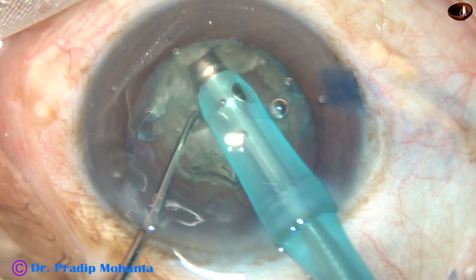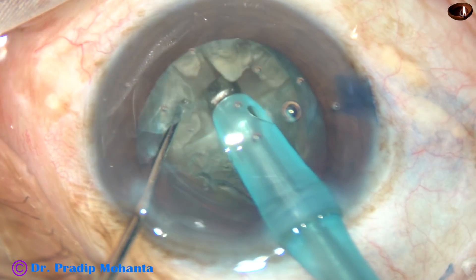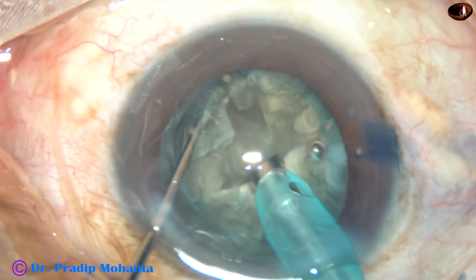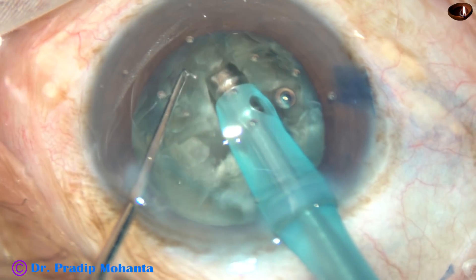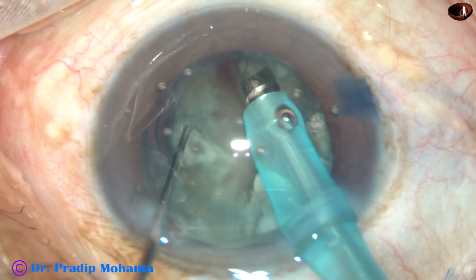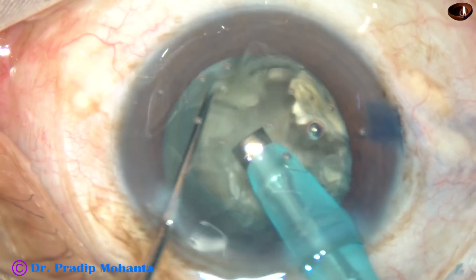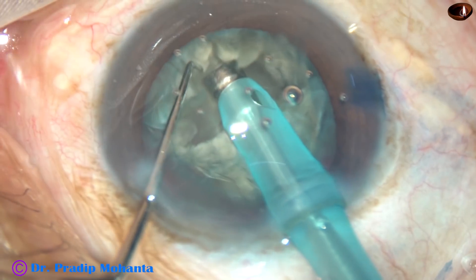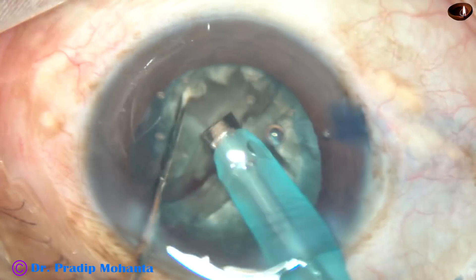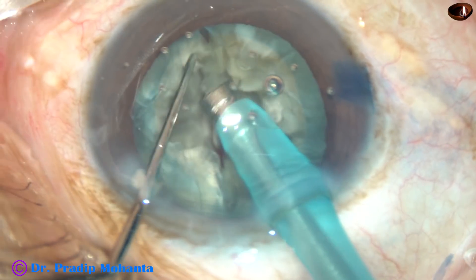Making almost a plus sign. Now this central portion must be deepened. We must remember the contour of the lens — it is a bi-convex structure, and the convexity of the posterior surface is much more than that of the anterior surface. After going to sufficient depth, if we observe a red glow at the floor of the grooves, we can try dividing the nucleus with the tip of the FACO handpiece and the chopper, dividing the nucleus into four pieces like this.